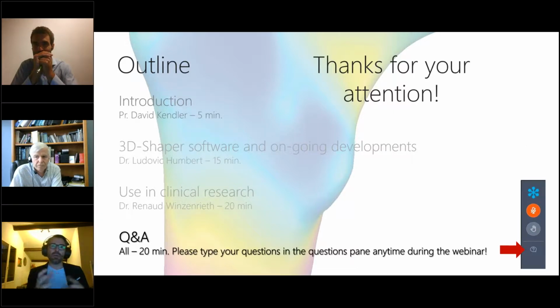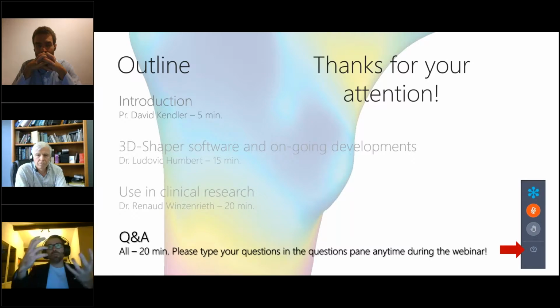We have two studies, one comparing subjects with and without acromegaly, and we have also analyzed the activity and severity of the disease and the association with fracture. We observed that the cortical density parameter is associated with the presence of fracture, which is not the case for areal BMD or for TBS. We have just finished the follow-up of this cohort. We have 2 years of follow-up, and again we have quite interesting results depending on subjects that switch from active to controlled disease. We have observed specific patterns in terms of changes inside the two compartments. Otherwise, we have almost nothing. So feel free to investigate.